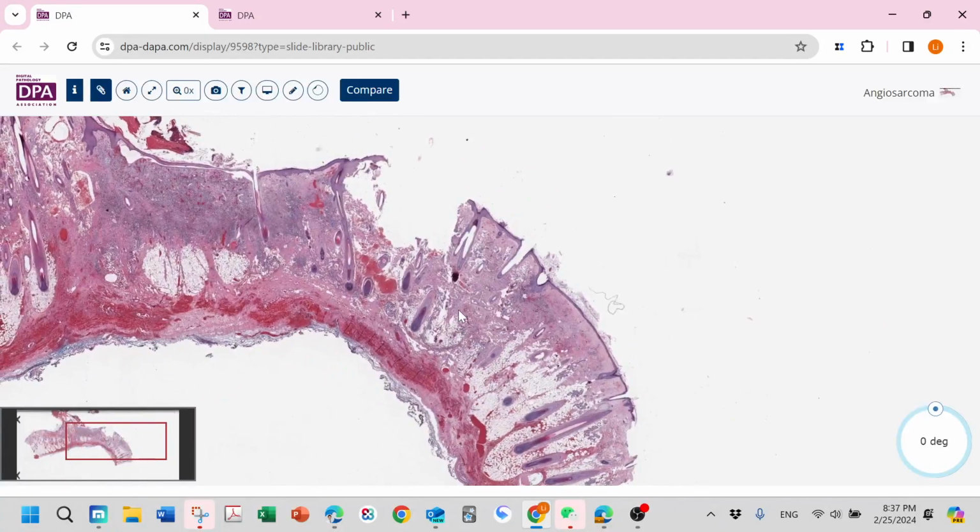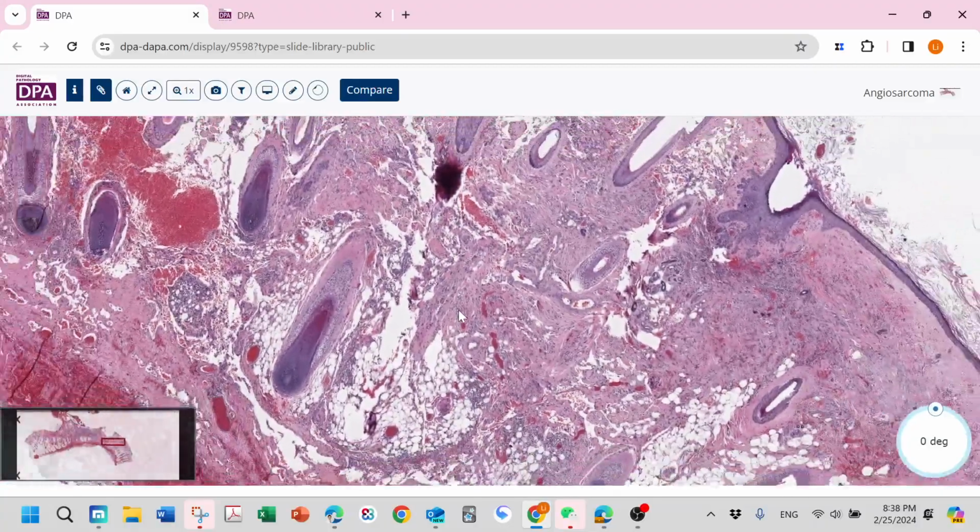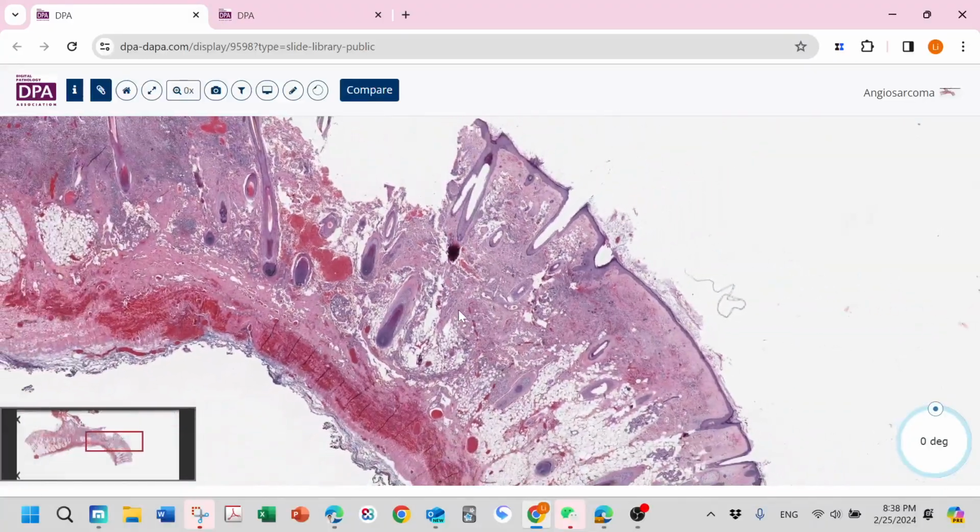If this lesion is radiation-related, like happening in the breast after irradiation, or maybe in head and neck tumor, the patient gets irradiation and then you get angiosarcoma, you can use C-MYC to highlight this post-radiation angiosarcoma, and then you can be sure of the diagnosis. But if not related to irradiation, C-MYC will be negative.